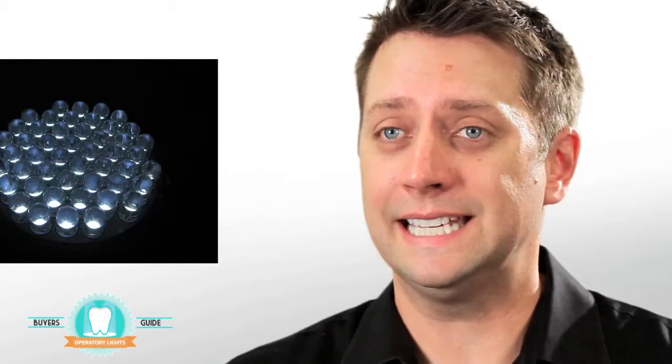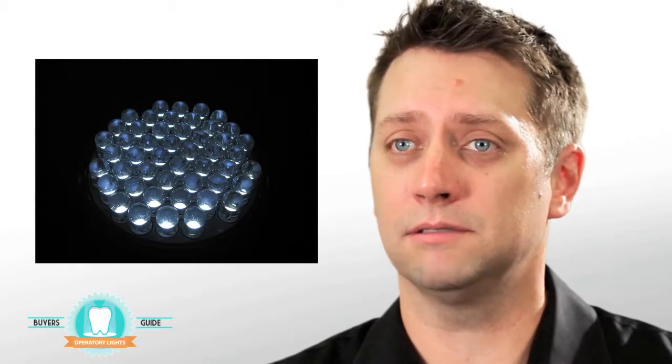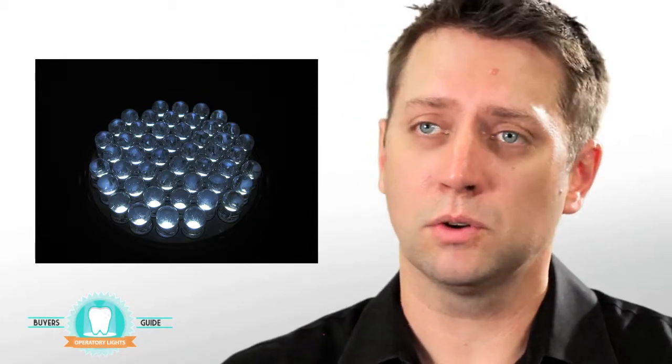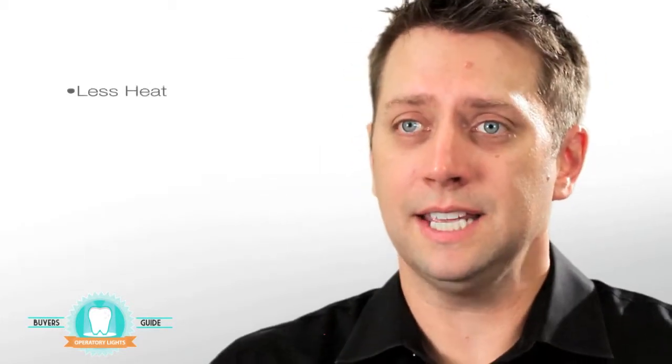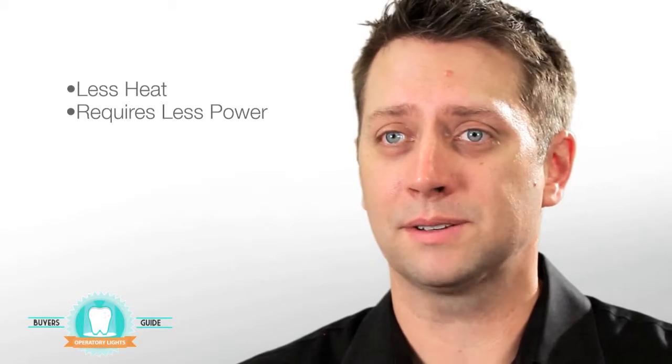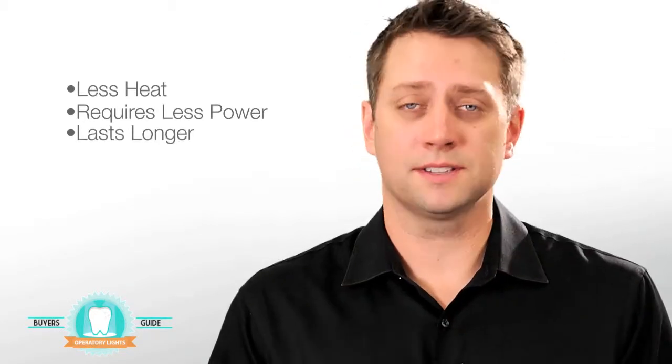Well, new on the market for dentistry now is LED lighting, light emitting diode. So rather than having a filament, you just have a block of material that releases this light. So why is it better? Well, it's less heat than traditional halogen lighting. It also requires less power. There's also nothing to basically break down, so they just last forever.